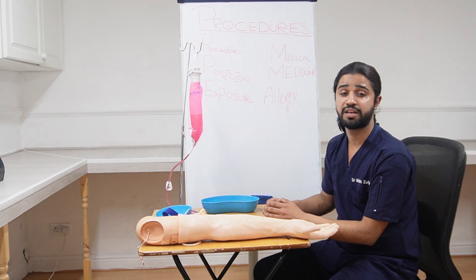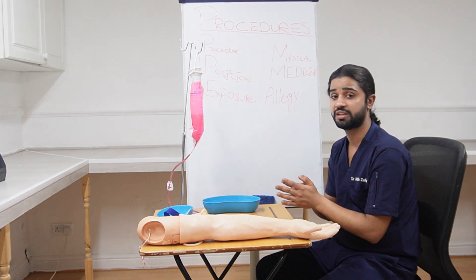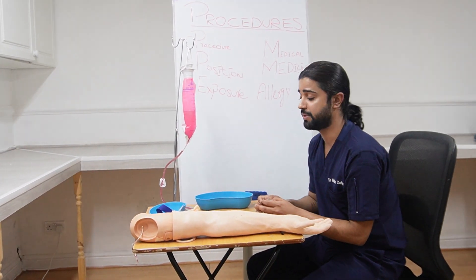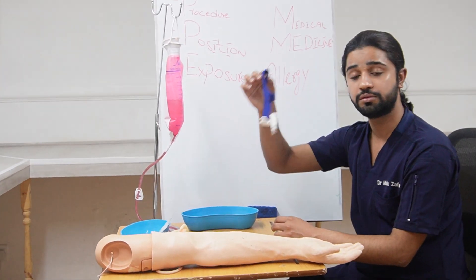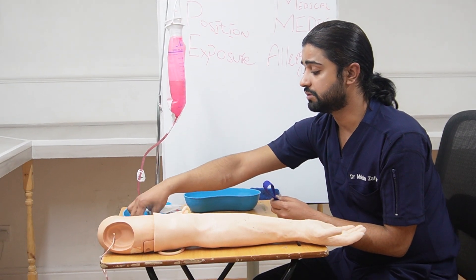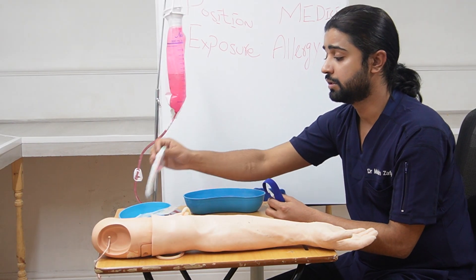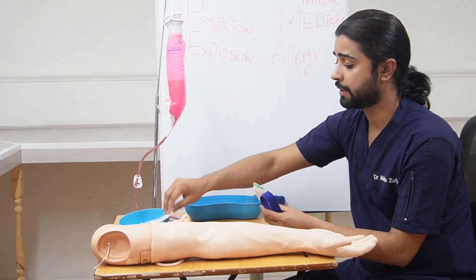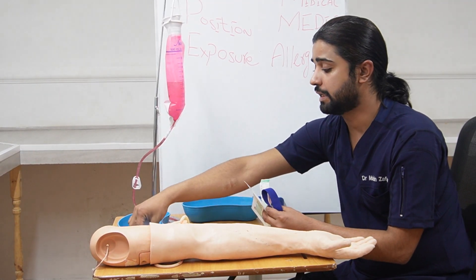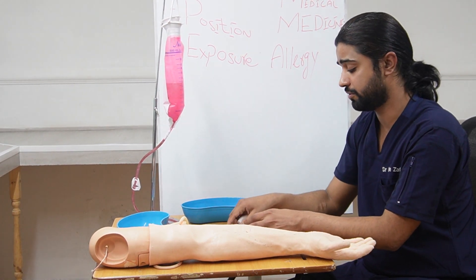Ask the patient if they have any arm soreness or any arm preference. Next, we will go through the things needed for this procedure: first we need a tourniquet, then an alcohol swab, then the IV cannula, then Tegaderm, a gauze piece, and a pre-filled syringe for flushing the cannula.